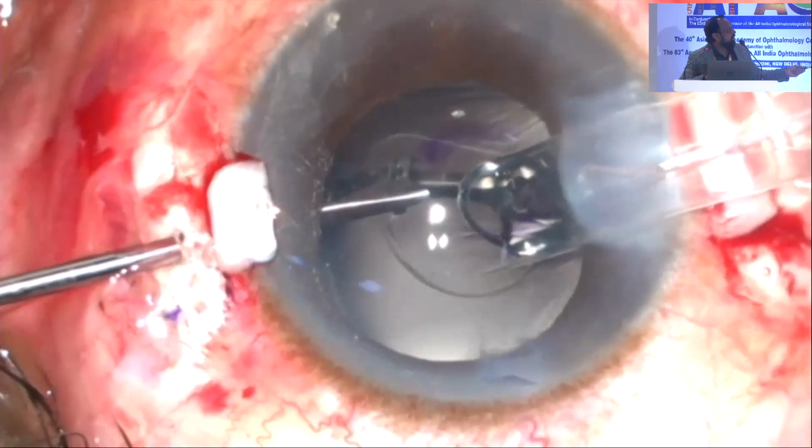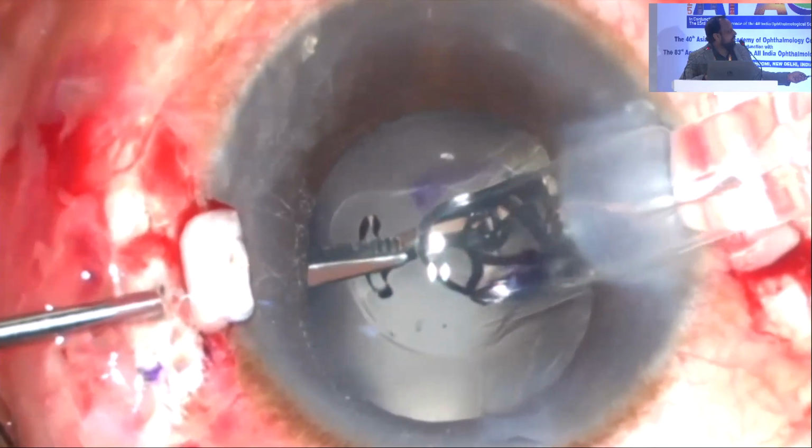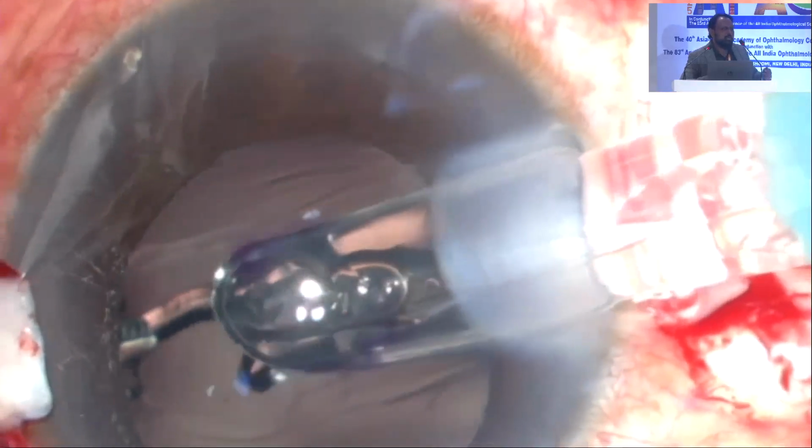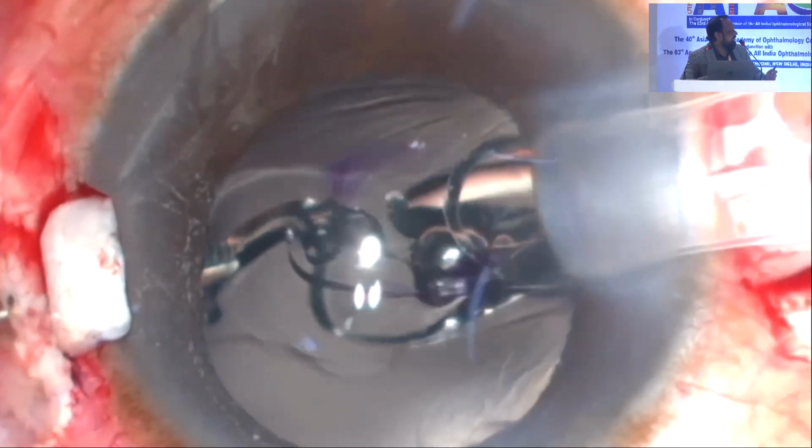Now, after 5 years of learning, we call this the head-on position. What happens is when this comes through the sclerostomy, the haptics bend inwards. So there is a lesser portion of that CMT flex lens that comes out, and that makes it smoother. Initially we were holding the neck here, which is a bulkier portion, so people used to tell that sometimes during pulling out it slips or breaks and you have to use more effort. So we call this the head-on position.